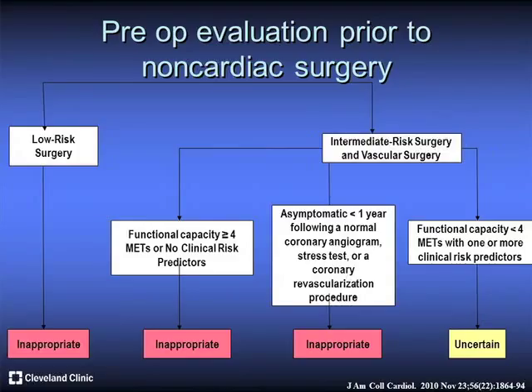And just evaluation of syncope, CT angio should not be the first line. There should be other things you do.